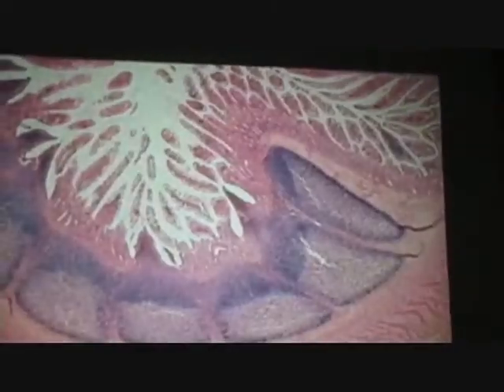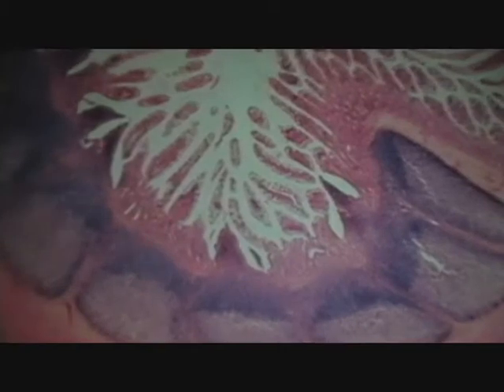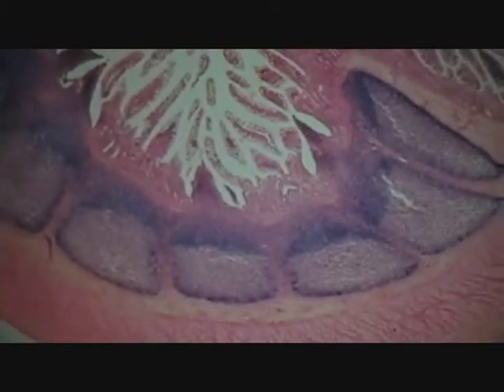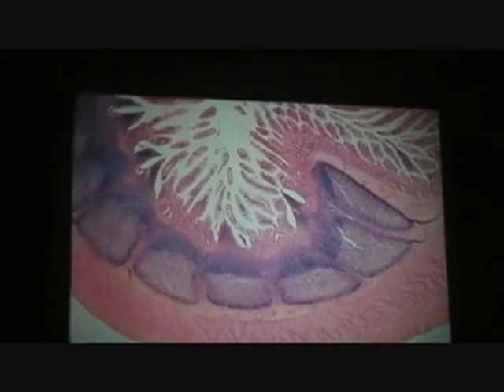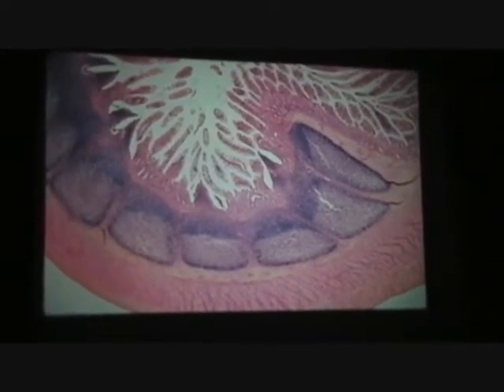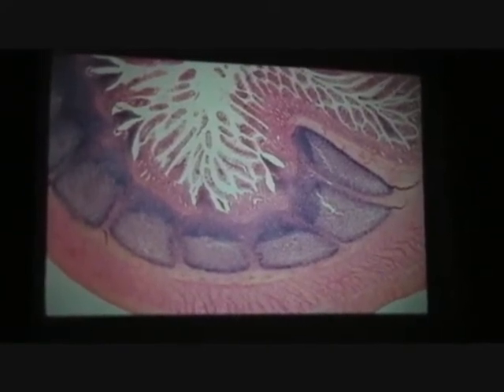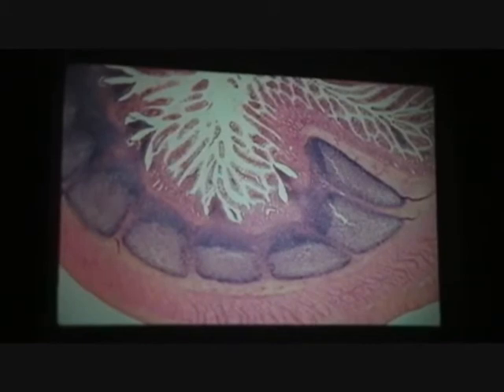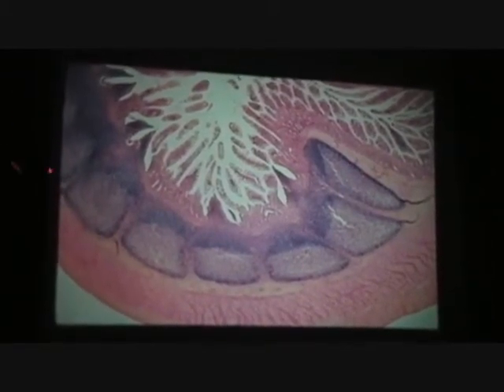Try another. Get some confidence built here. What compartment of the GI tract does that have to come from? What tells you that? Yeah, gotta be a Peyer's patch.